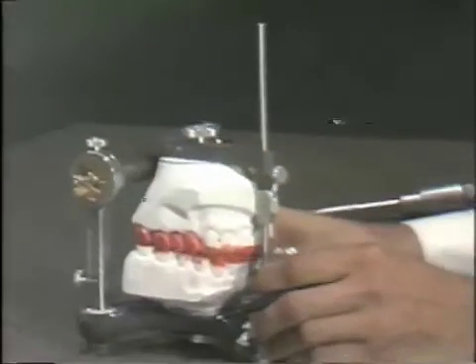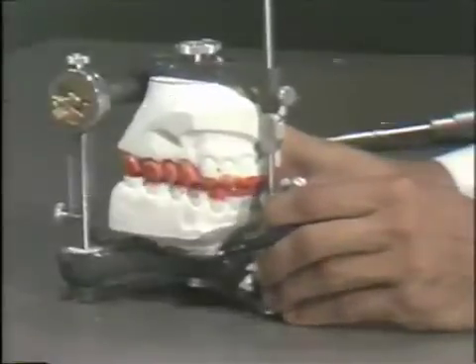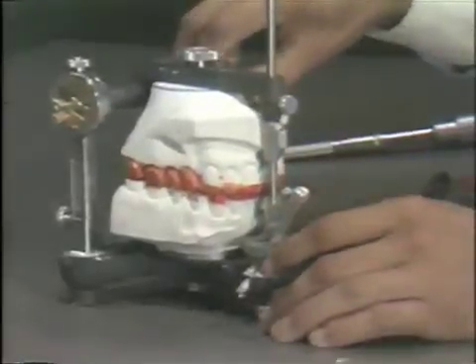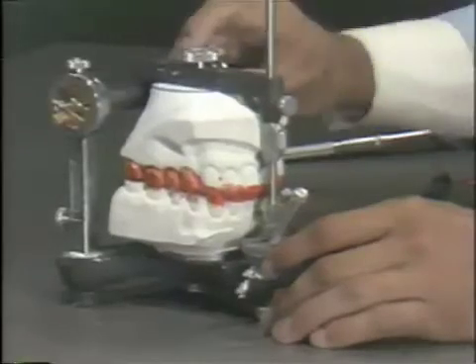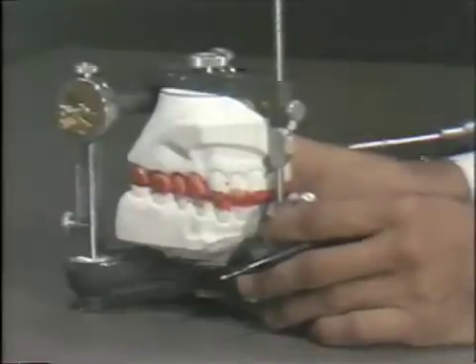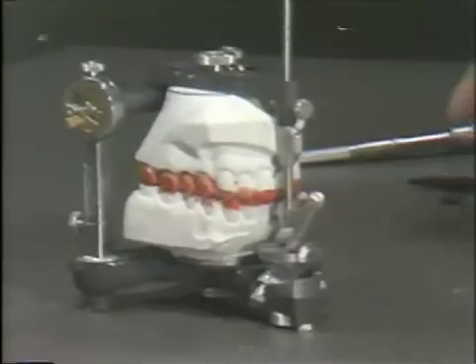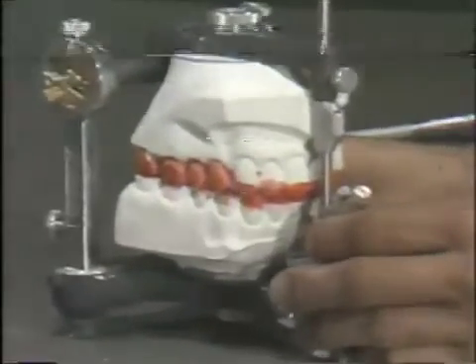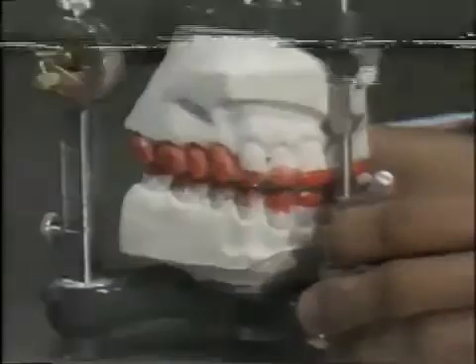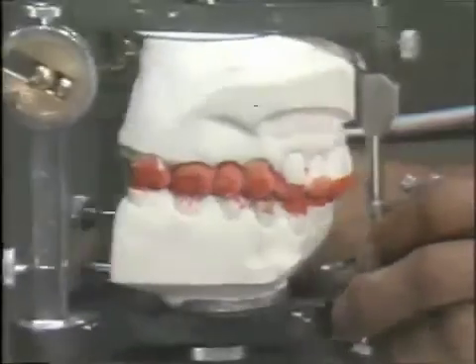At this stage, one has, from centric occlusion, a smooth lateral excursion to the right and to the left with no balancing interferences present. If the shims are taken away and out of the area, now the casts can go forward into the centric relation. Again, you can see the freedom in centric present. One would also have to check to make sure that in this forward position in centric relation — that is the forward position of the maxillary cast — that in this excursion again, it is smooth and the cuspid rise is still performing its function.